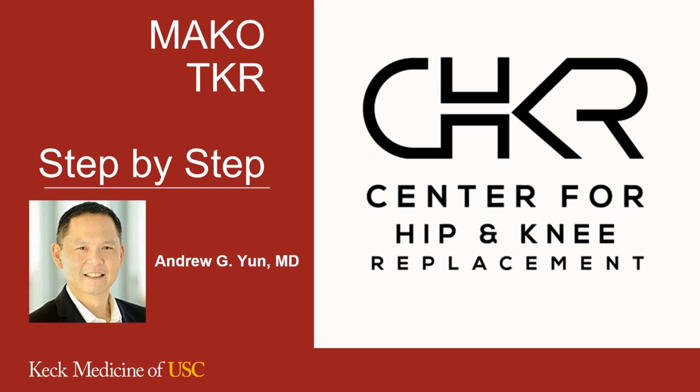This will be a slightly longer video. This will be more process oriented. We're going to go step by step through the process of a MAKO total knee replacement and how we take the three-dimensional images, then break them down into the coronal, axial, and sagittal, the femoral and tibial sides, and then look at how we can look at translation as well as rotation of the components to make sure that we've achieved a balanced and aligned knee replacement.